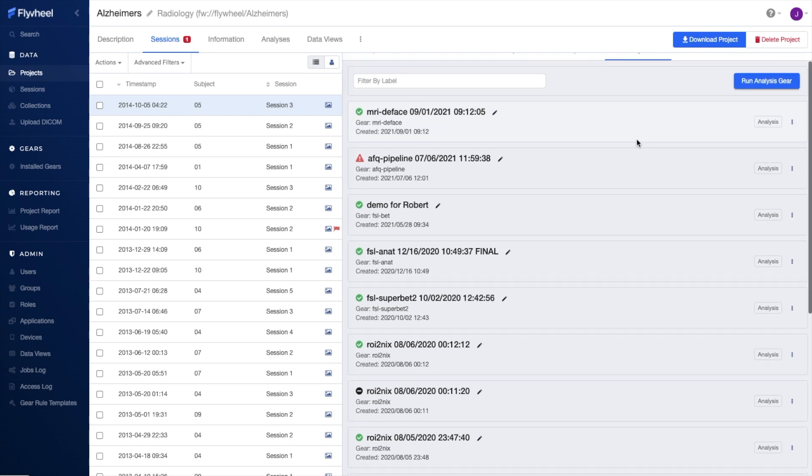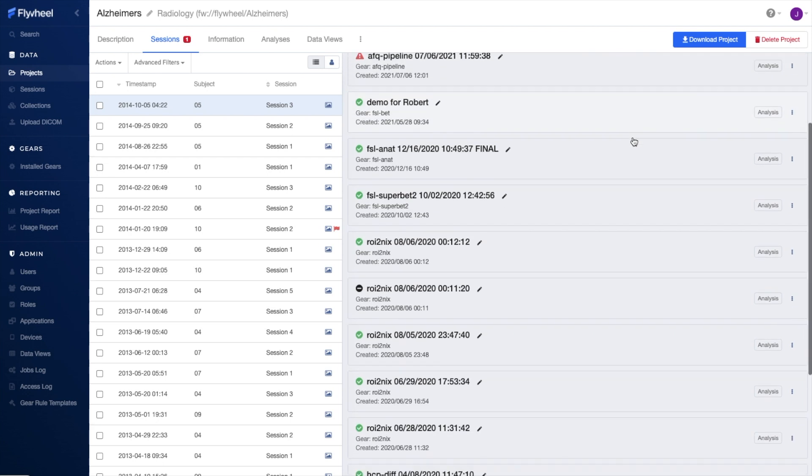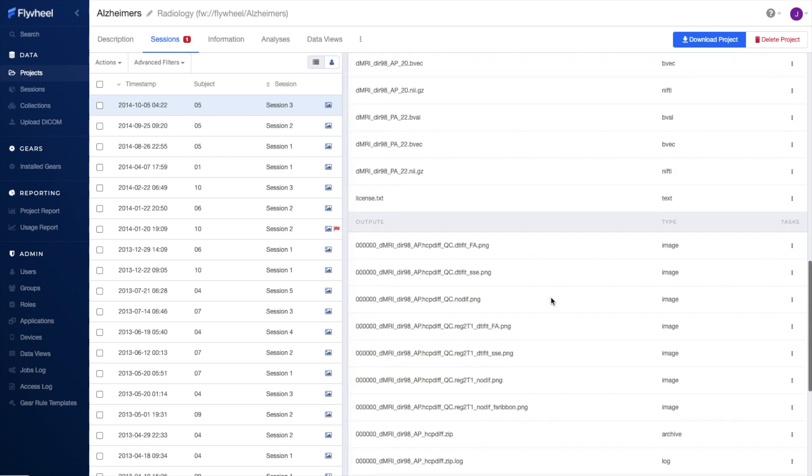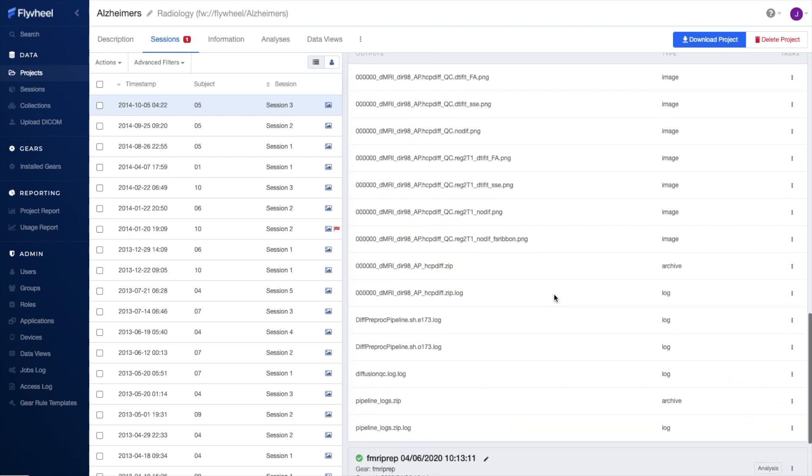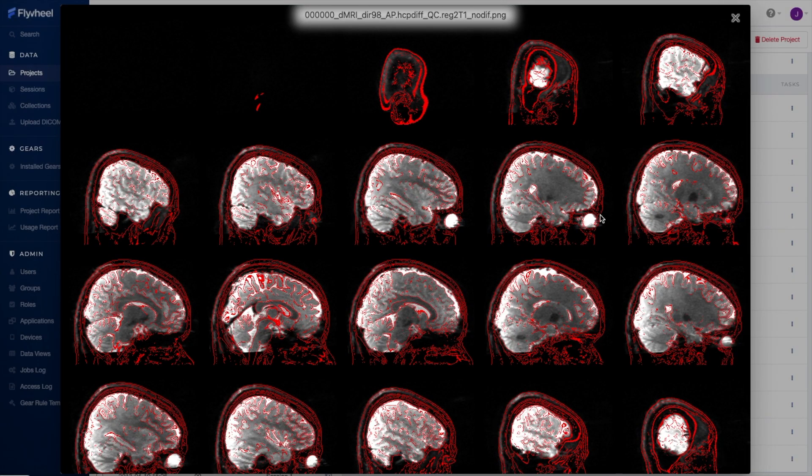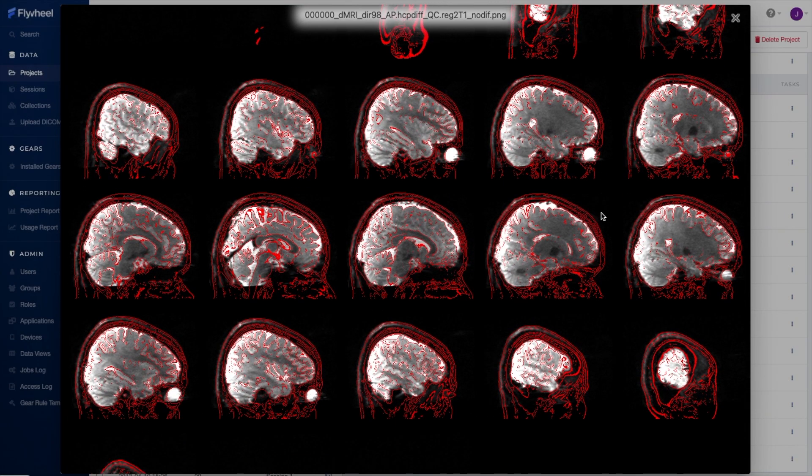Running an analysis gear creates a discrete analysis object here in my analysis tab. I can view the outputs, provide notes for collaborators, and get gear configuration and logs for this particular analysis.